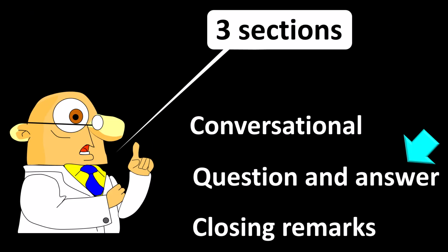This concludes the question and answer section of this talk. I will now make some closing remarks. These closing remarks will be divided in two parts. In the first part, I will summarize the good and the bad about the most commonly used montages. In the second part, I will provide you with a roadmap, the roadmap that I use most of the time to read an EEG.